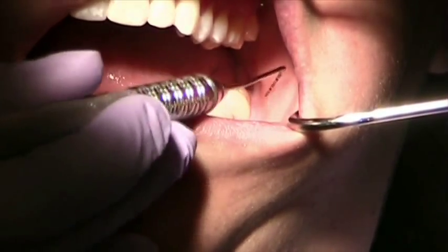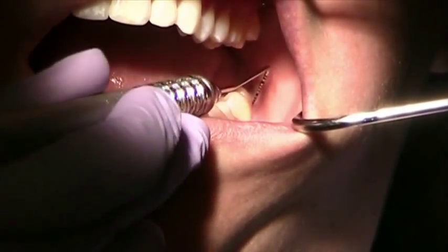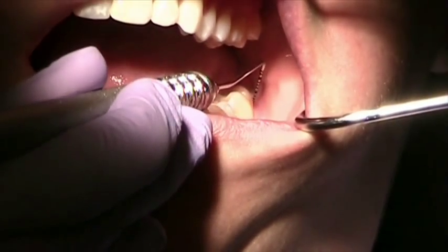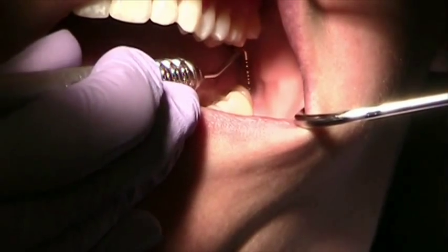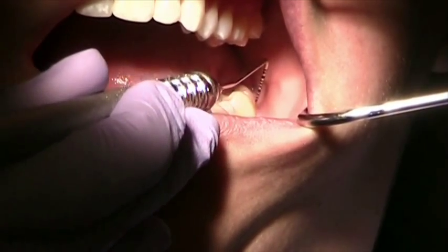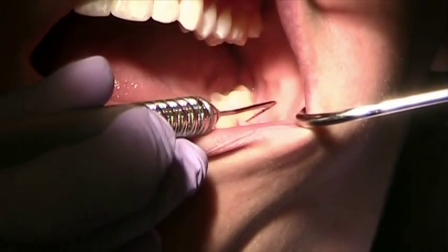The use of an Explorer may aid you in feeling the CEJ if you are having difficulty feeling it with a probe. In most cases, you will not be able to feel the CEJ as a perfect band around the tooth. So with the Explorer and a light pressure, you can feel the change from the smooth enamel of the crown to the rougher cementum of the root surface. The clinician can now insert the probe until the tip reaches the CEJ and record the reading at the gingival margin. On this tooth, the measurement from the CEJ to the gingival margin is 2 millimeters of inflamed gingiva, also known as a pseudopocket on the distal.